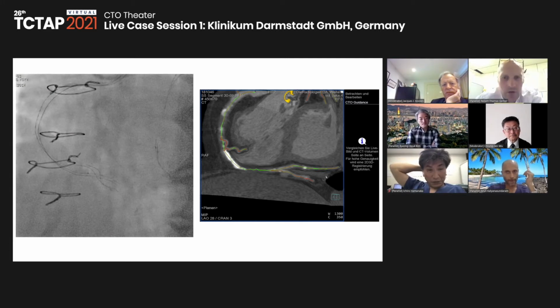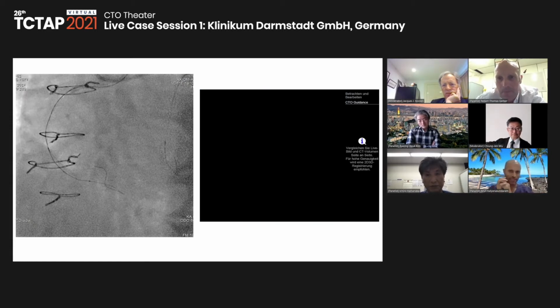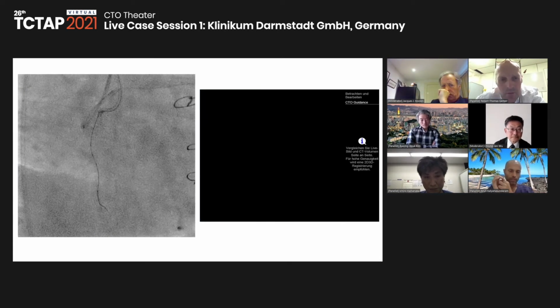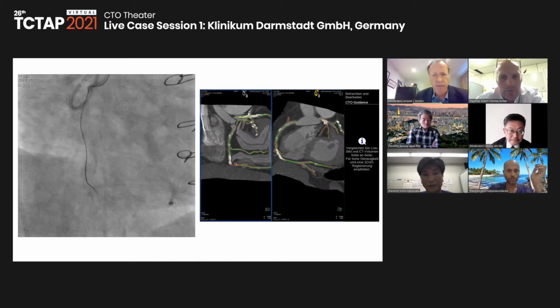I mean, if you haven't got much contrast usage, what about doing a contralateral now? Yes, I will do. That's a good idea. And your creatinine's normal. I just had to add some heparin. We were again down to 204, despite having given 5,000. Just no contrast is fortunately not a big issue here. Do you have a warning system for that? I see he has a GFR of 130, and X-ray contrast uses about 100 cc.